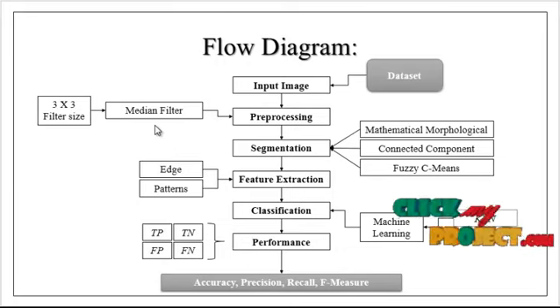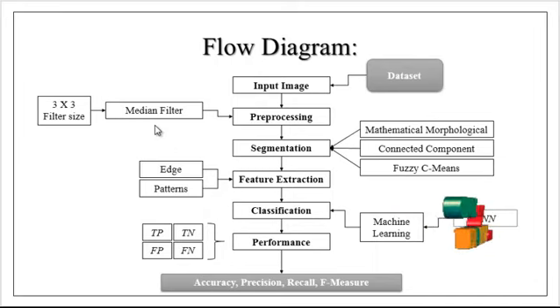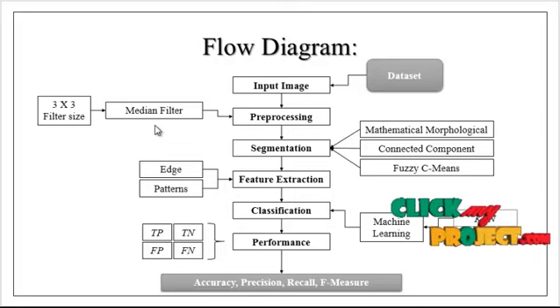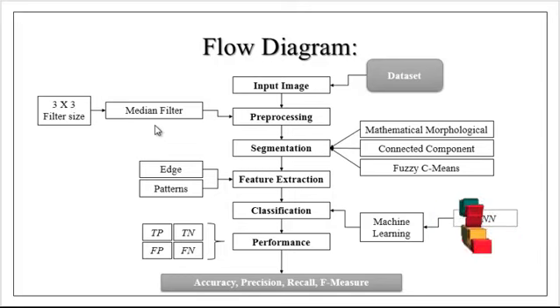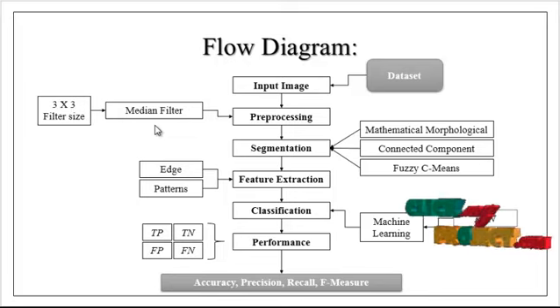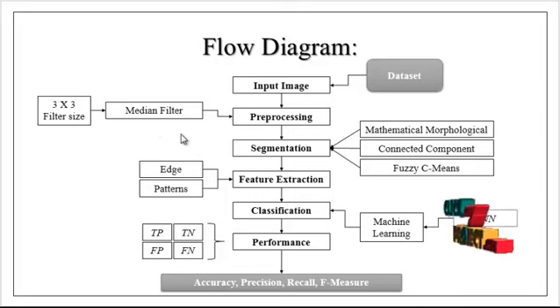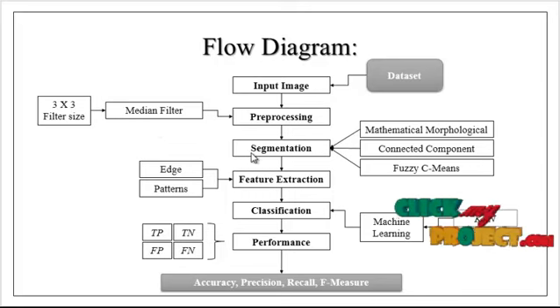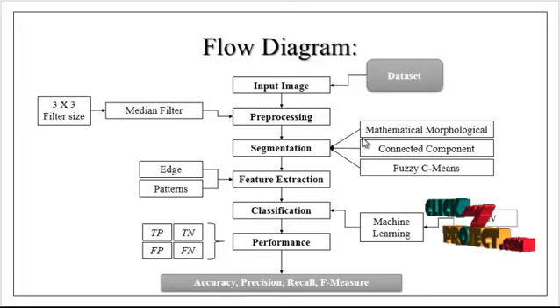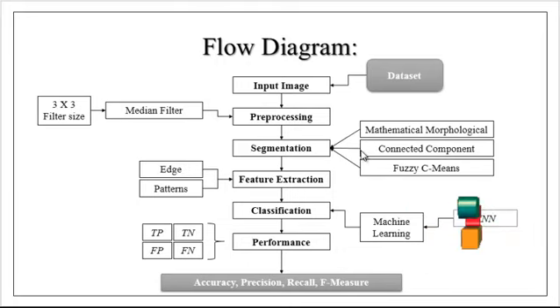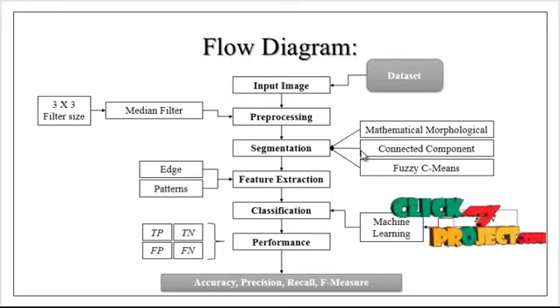After applying the median filter, we resize the image to 256×256, meaning the number of rows will be 256 and the number of columns will be 256. After applying the median filter and image resize, we move to the segmentation portion. In segmentation, the primary component is the mathematical morphological model to segment the tumor region. After that, connected component analysis is applied to remove unwanted regions present in the background.